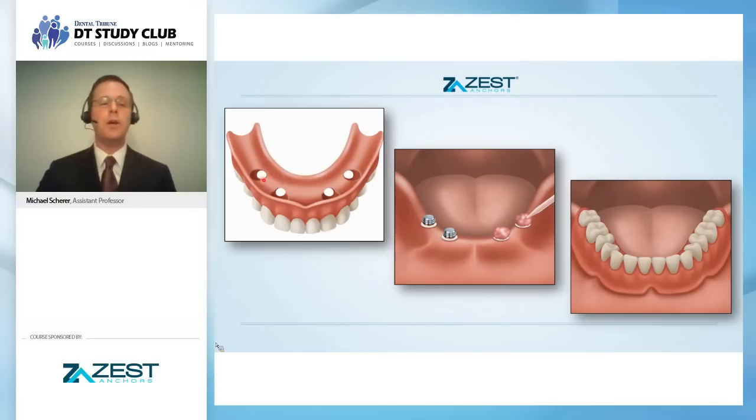And now I know at Loma Linda, what we tend to teach a lot of the residents is an injection method where we create a hole in this surface right here and then a little bit different sized hole on the lingual surface. And you're going to be injecting resin from one side to the other, creating almost a turbulent flow situation while the denture is fully seated to the tissue. And that works as well. So depending upon your comfort level, me personally, I like to use a relief hole. I don't like to put material on the actual housings. I tend to find that it makes it a little bit messy and you tend to overbuild your attachments.